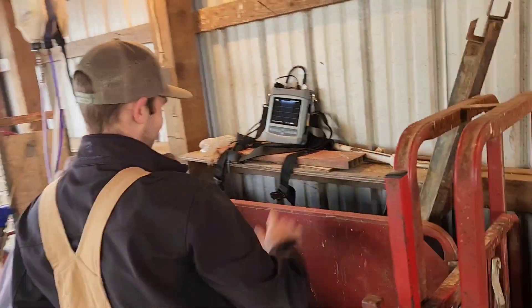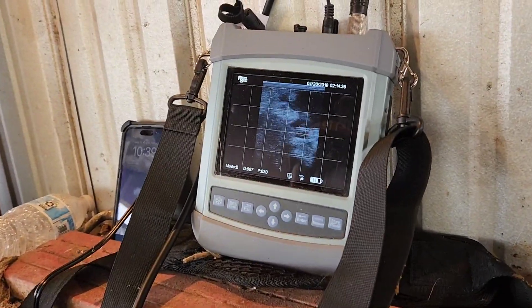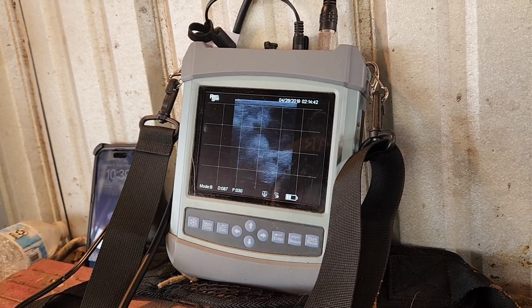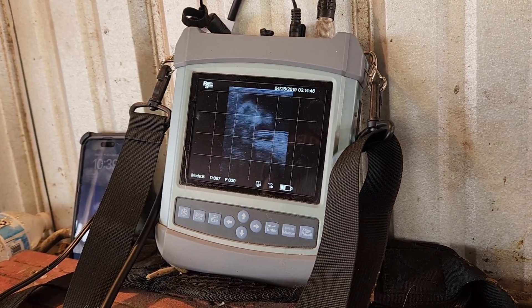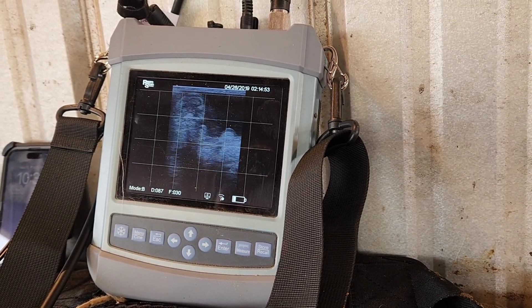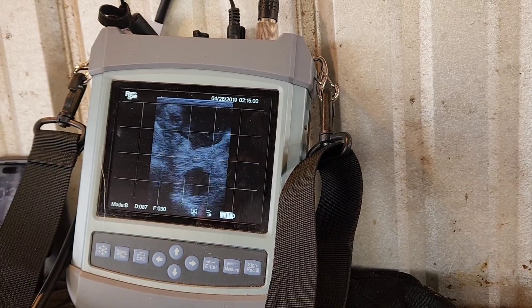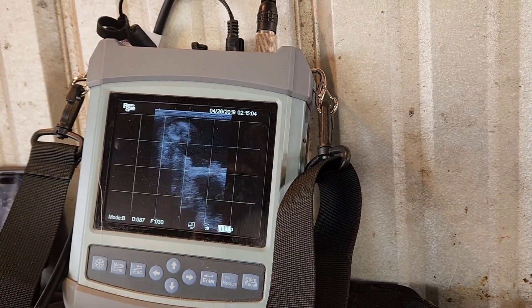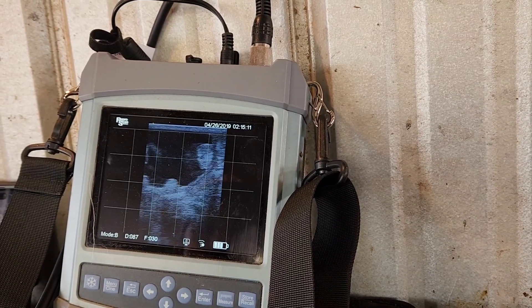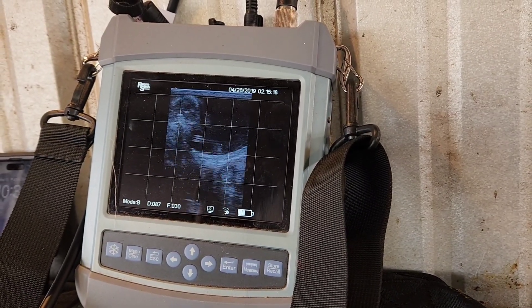You better have some training before you try this at home. The head's up top and you can see the rib lines down low. You can see an eye right there. The cotyledons look like little crescent moon, donut-type mushroom shapes — people call them a lot of different things — but that's what we're looking for. That's where the placenta attaches to the uterus.